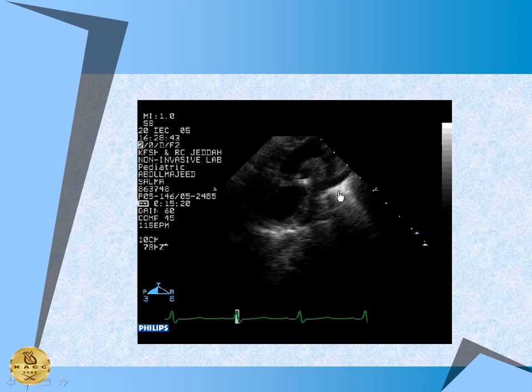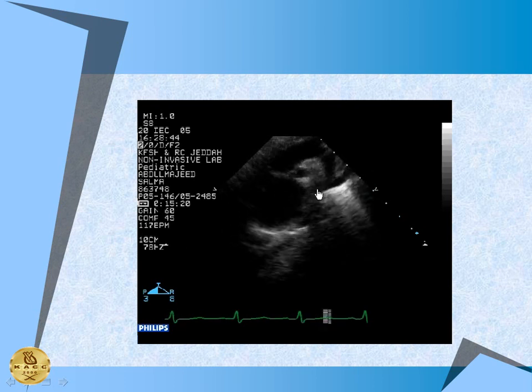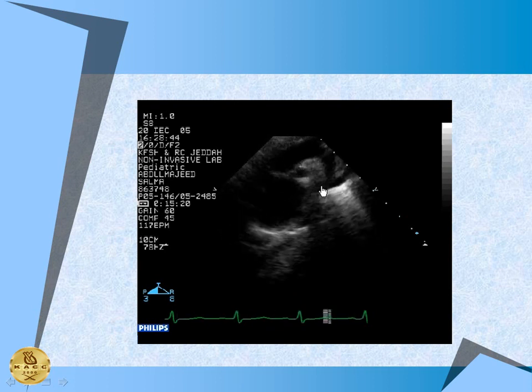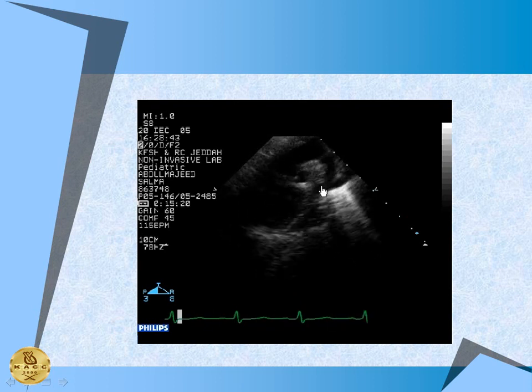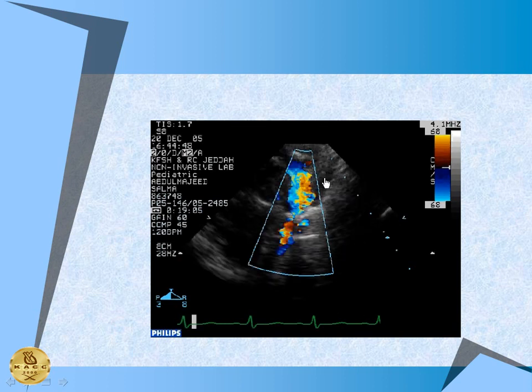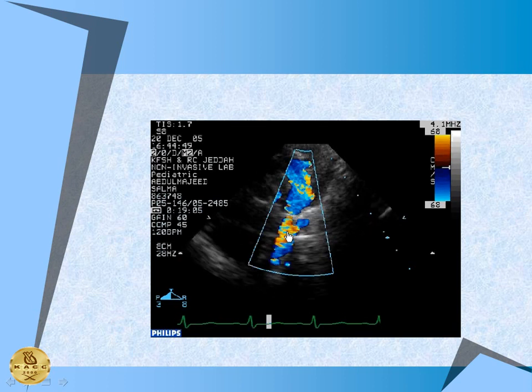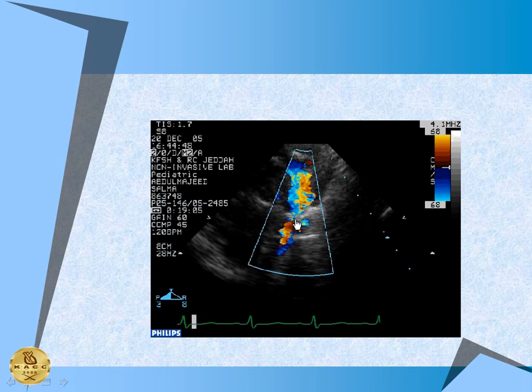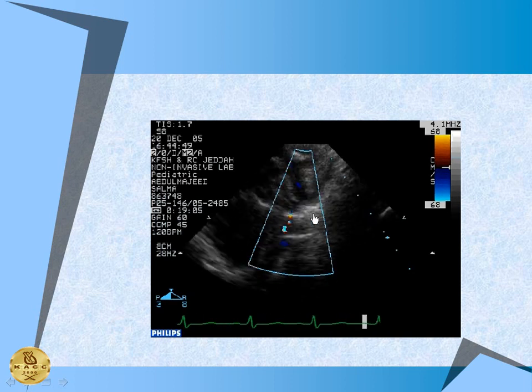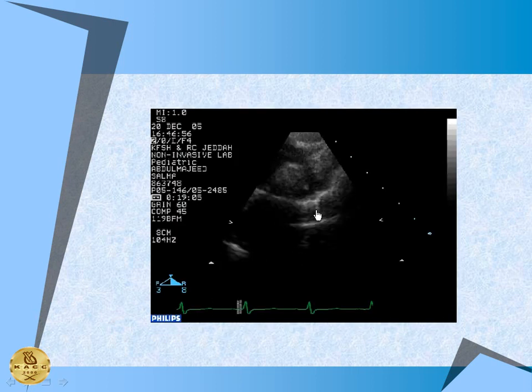Okay, this is another sign of detecting coarctation. If you see the subclavian so much pushed down and displaced laterally, even if you don't see a coarctation, you should say, I highly suspect a coarctation. No gradient or a gradient, you saw the shelf or you didn't, this must be something to consider. And look in this patient, how it actually was. Look at the subclavian where it is, and look at what the coarctation is. Very further down. And probably this could be easily missed if somebody did not concentrate on the displacement.